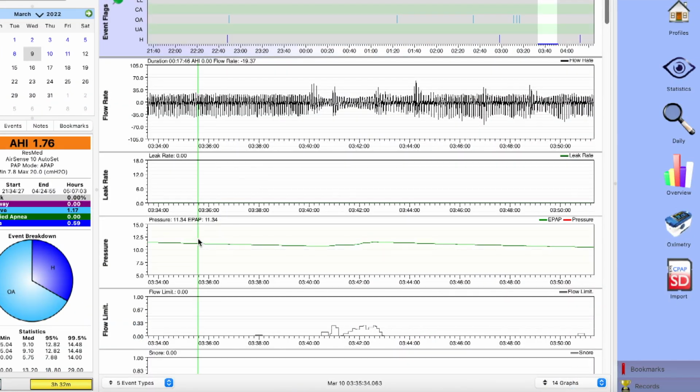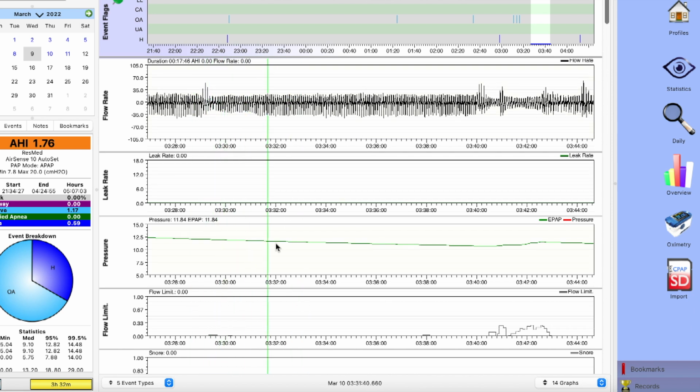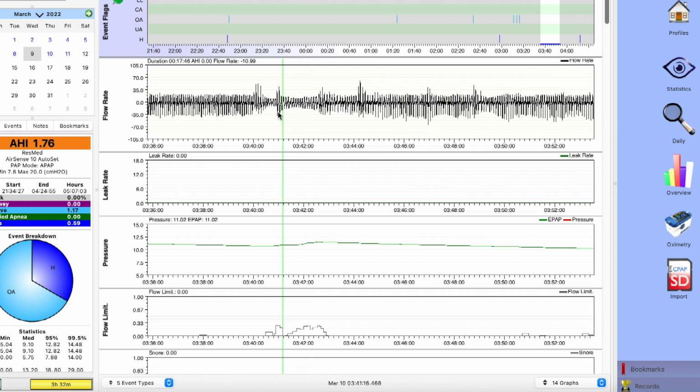Here is an Oscar screenshot. Now this is the standard algorithm. You can see the pressure is decreasing. Why? I don't know. They're just cruising along and the pressure is dropping. Why would it drop if it's not detecting events? Apparently, air quotes, they're doing well. Why decrease?